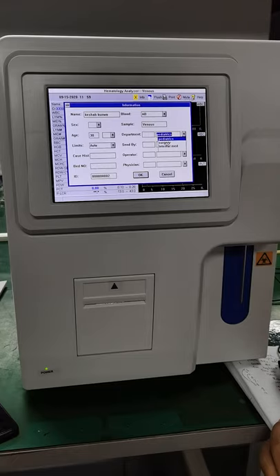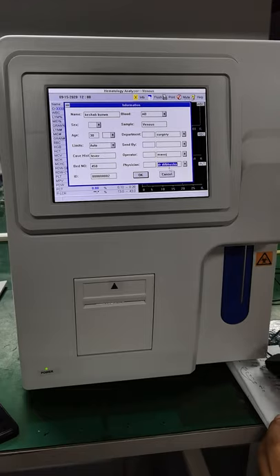Let's say surgery, limits, it's okay, auto, sent by, we can add this information later. Case history, suppose he has fever, okay. And operator, it is Manoj, let's say. Bed number, let's suppose 450. Physicians, it is seen by physician Dilbushan.